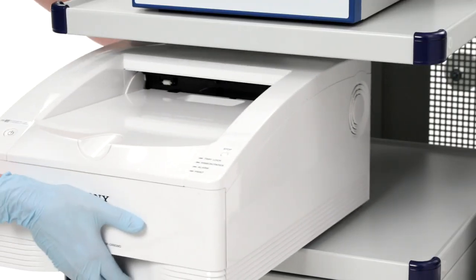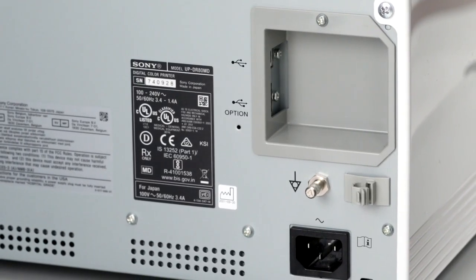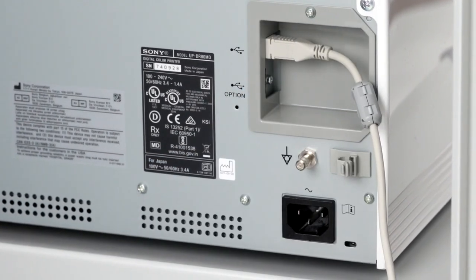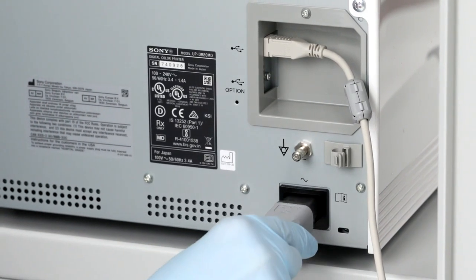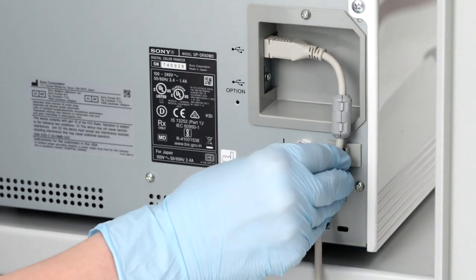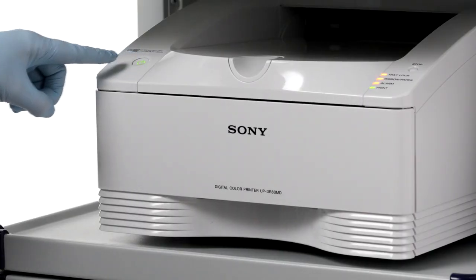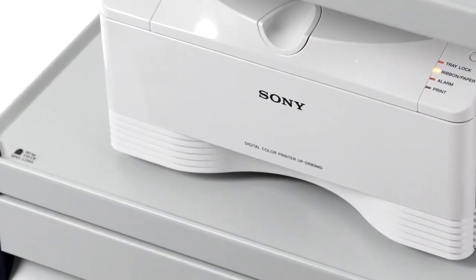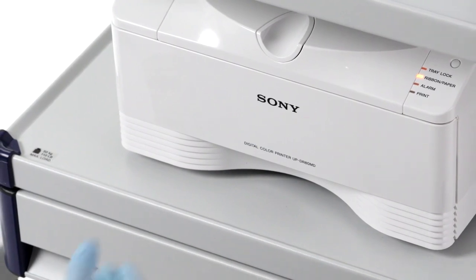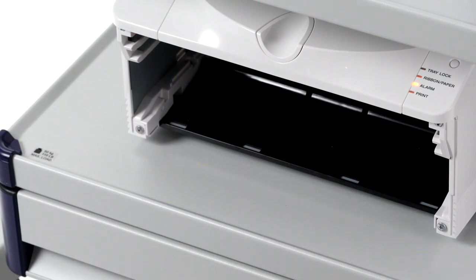To prepare the printer, you'll need to connect the USB cable to the printer and the MVR Pro, then connect the power cord. Once it's connected, secure the cable stopper. After connecting the printer to the MVR Pro, turn on the printer. Before you can begin printing, you'll need to load the paper and ink ribbon. Make sure you're using compatible ink ribbon and paper, and pull out the media tray, which is normally locked in place. To unlock, simply pull the lever.